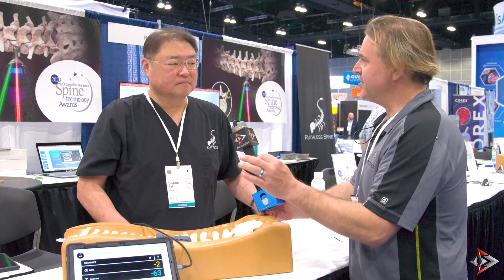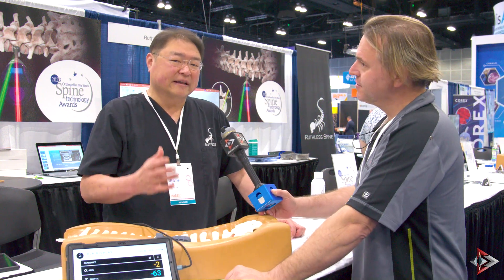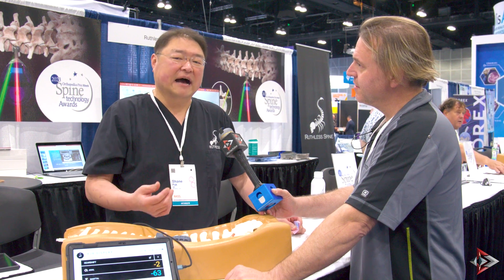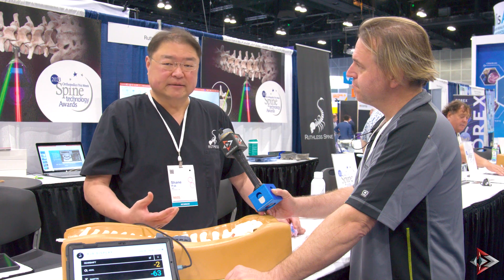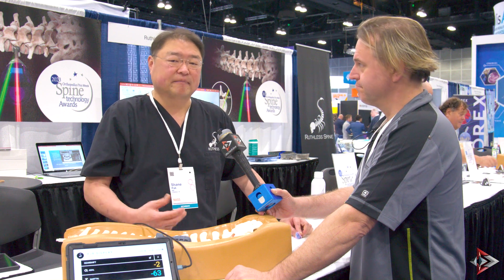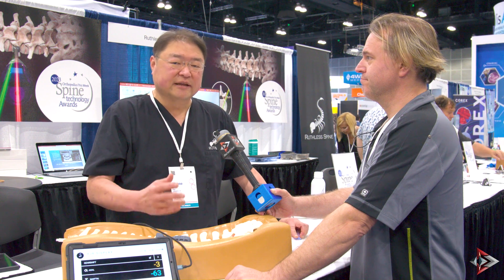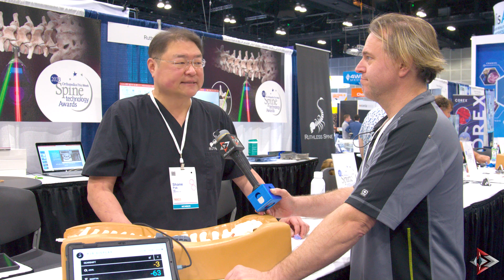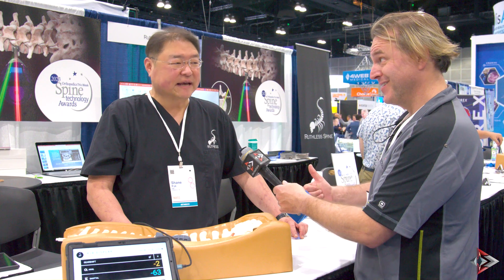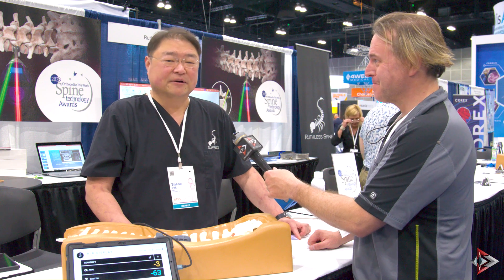The advantage is to the system, to the surgeon, and to the patient. We know that unnavigated screws, especially in the thoracic spine, have a high rate of malplacement, and malpositioned screws are one of the leading causes for taking patients back to the operating room. Anything to improve the accuracy of screws will significantly improve the patient care experience. Congratulations — we are FDA approved and ready to go to market in the United States and anywhere that FDA-approved medical implants are allowed.